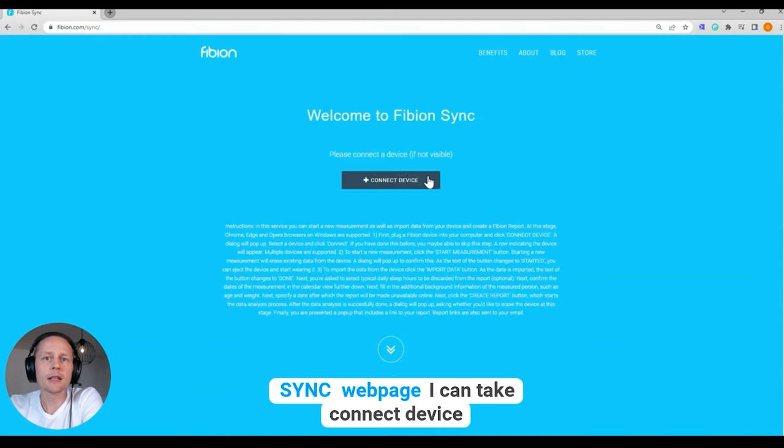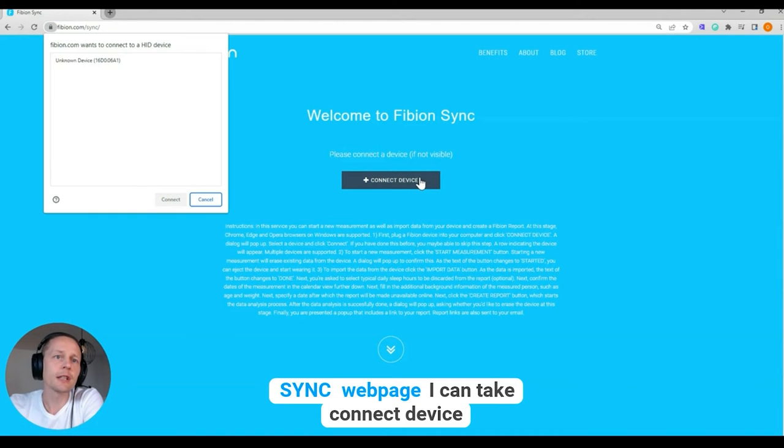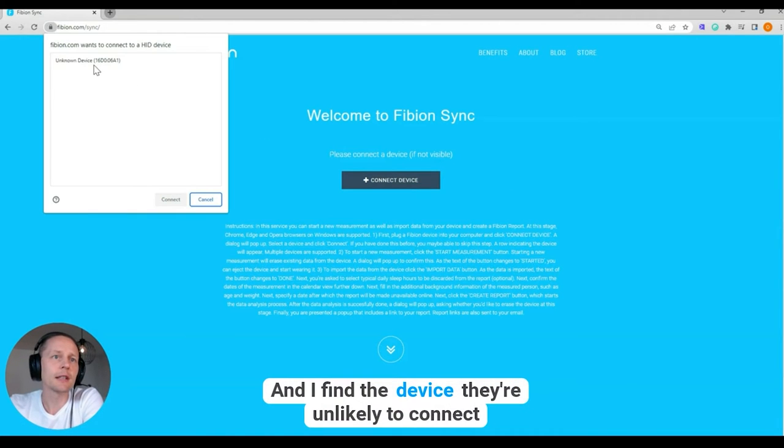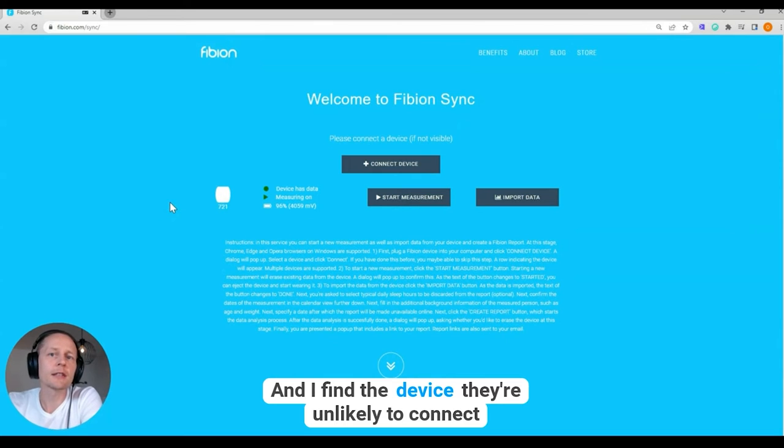I can click 'Connect Device' and I find the device there, then I click connect.